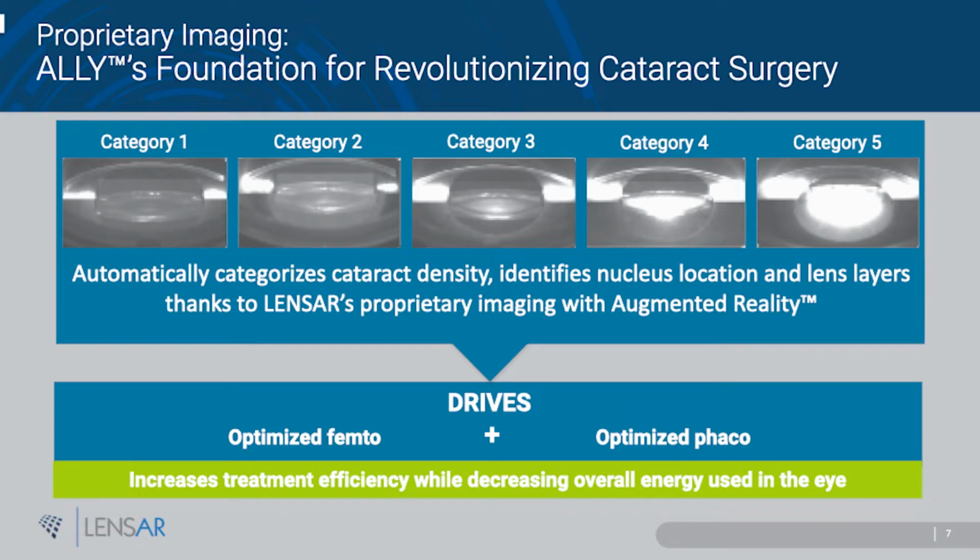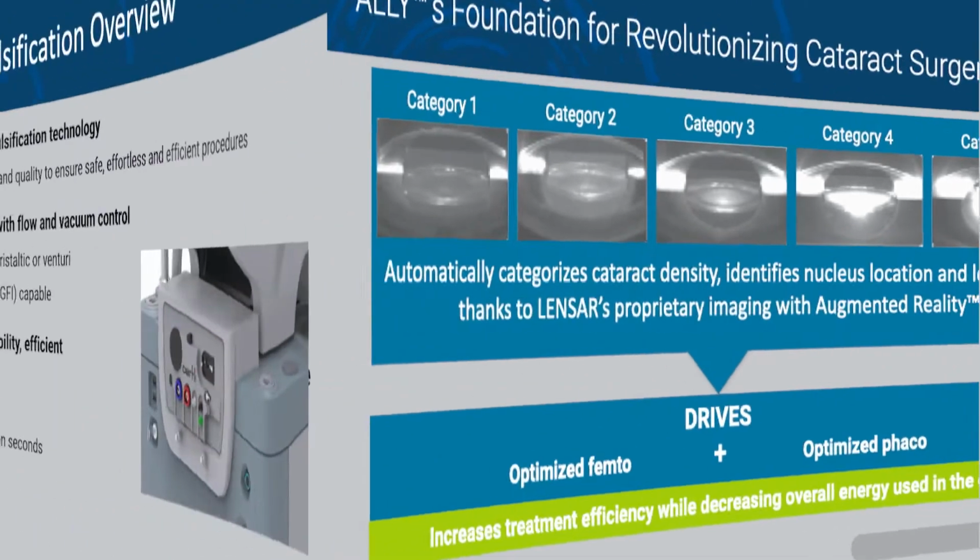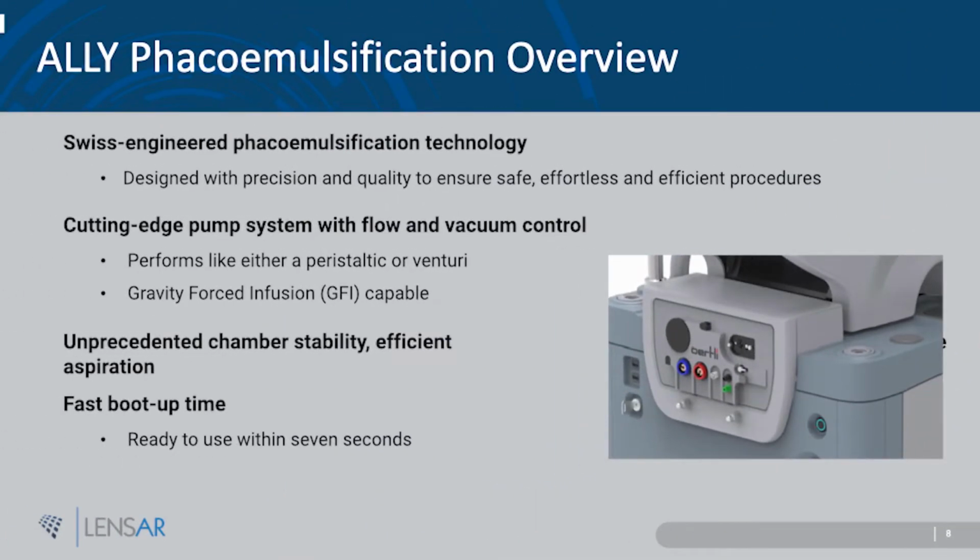We're probably going to broaden these categories to be more specific to different grade nucleus and size. And we just went through the early integration part, and that will be the Pharos that you see there. Very good integration, and everything will be done sterilely.